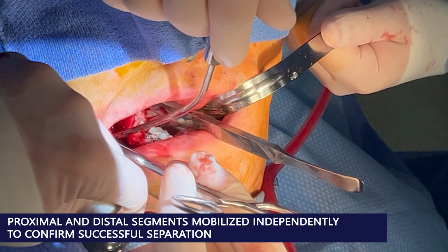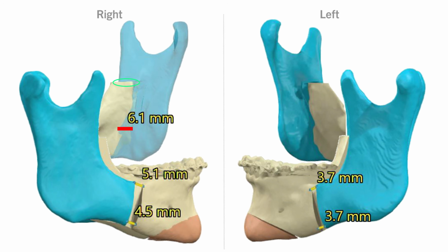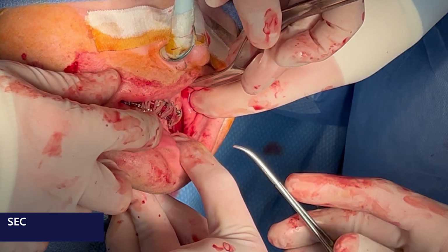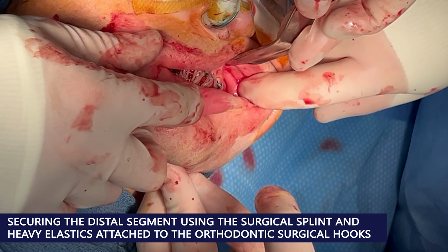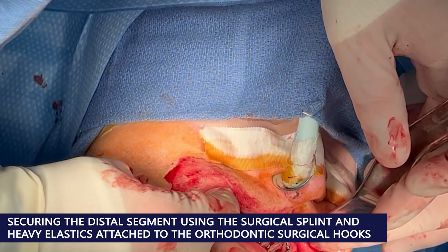Once both sides are mobilized, I advance the distal segment 5 millimeters using the prefabricated splint to guide occlusion. I then use a trocar to achieve rigid fixation using bicortical screws.